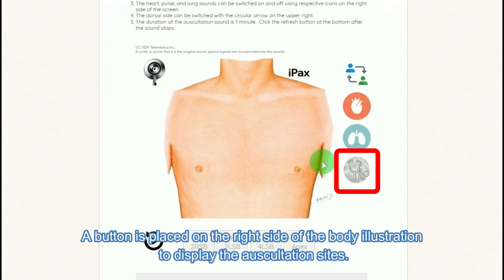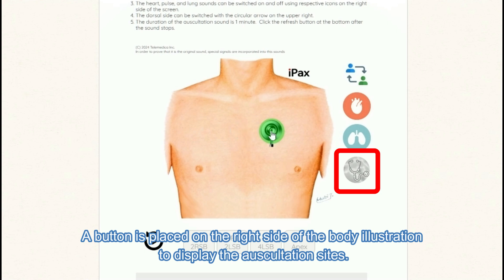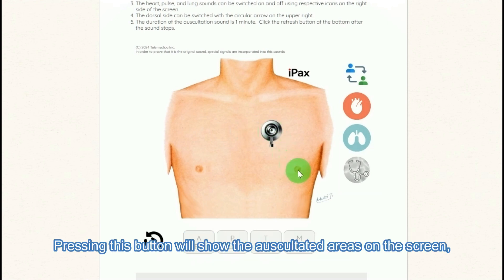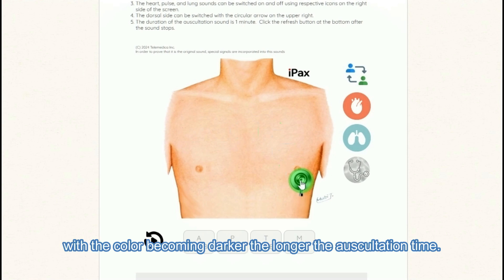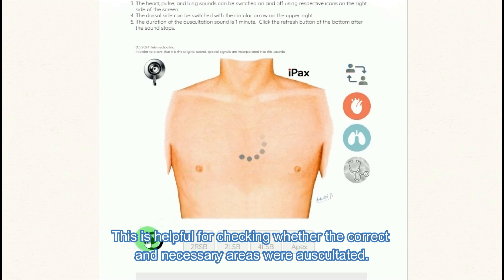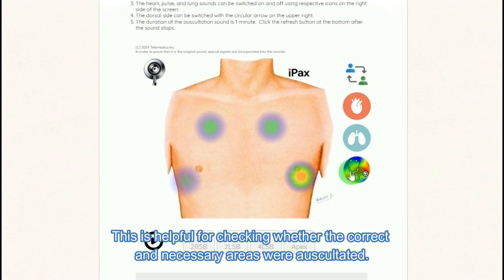A button is placed on the right side of the body illustration to display the auscultation sites. Pressing this button will show the auscultated areas on the screen, with the color becoming darker the longer the auscultation time. This is helpful for checking whether the correct and necessary areas were auscultated.